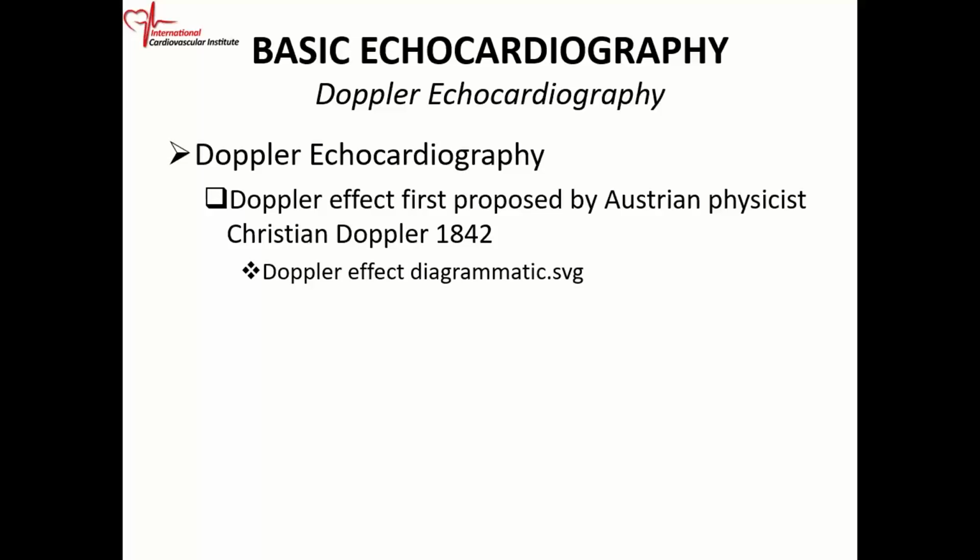So that is essential to the Doppler effect. When a moving object is making a sound and approaches a target, it appears to have an increase in frequency, and then when it moves away, it appears to have a decreased frequency. And that is essentially the Doppler effect.